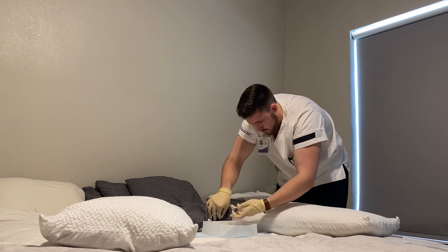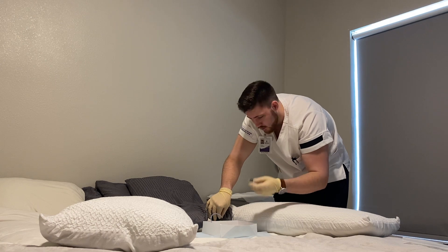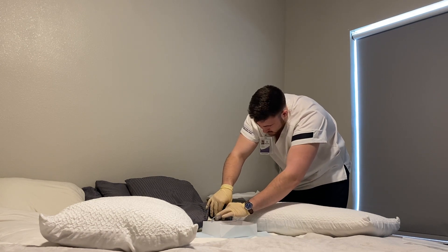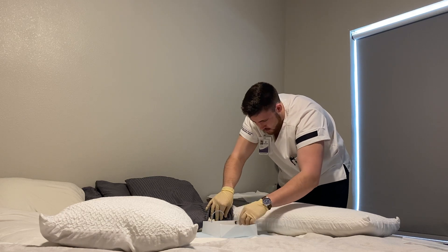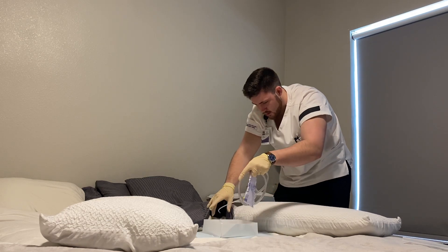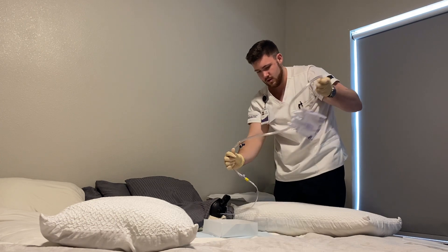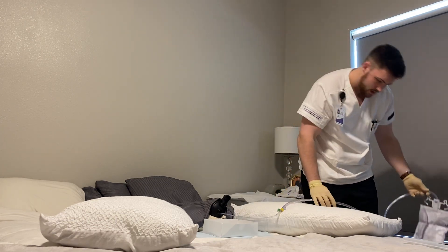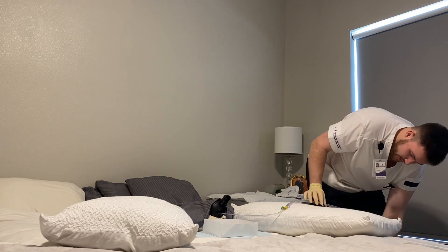Take the syringe off. Record that you put 9 milliliters in. Give it a tug to make sure it's in there. Bring it around the client's inner thigh. Hook to the bed frame and tape to inner thigh.